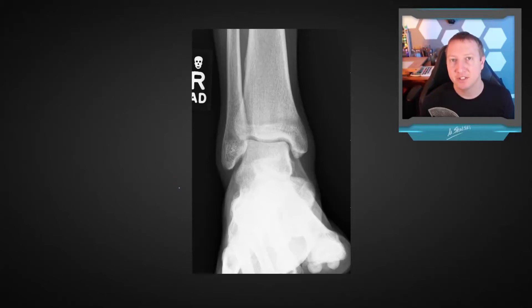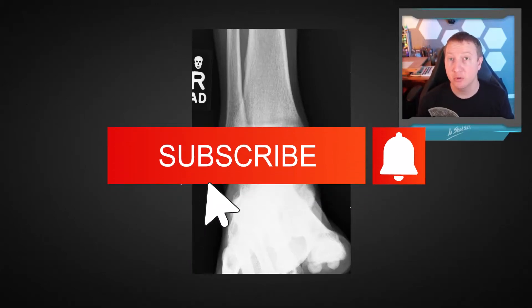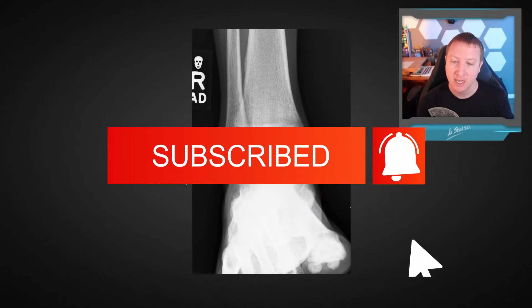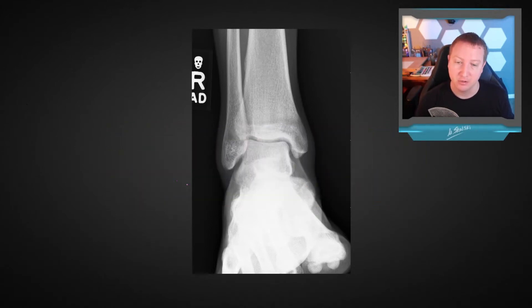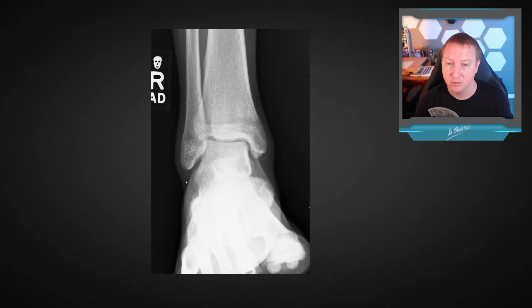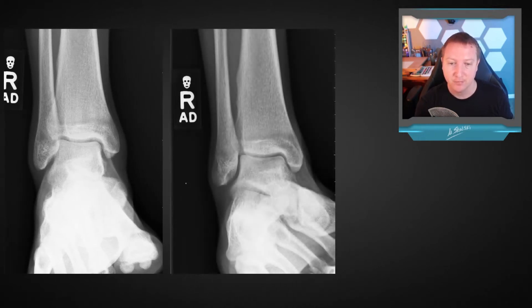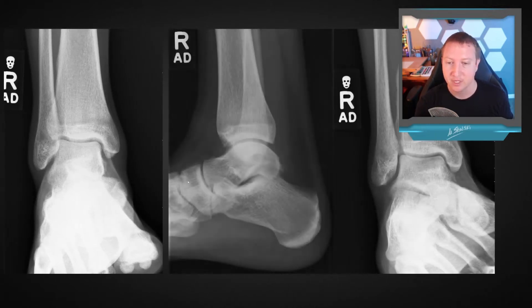Hi, I'm Dr. Matt Skulski, and in this video I want to review the normal radiographic anatomy of the ankle with you. As part of our standard normal minimum ankle series, we're going to have an AP view, a medial oblique view, and a lateral view.